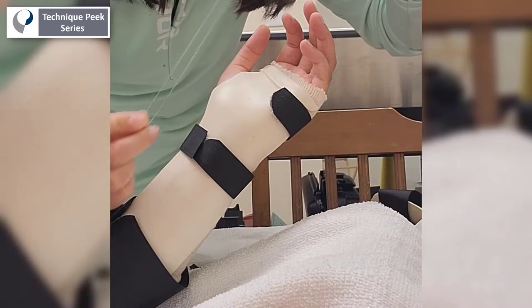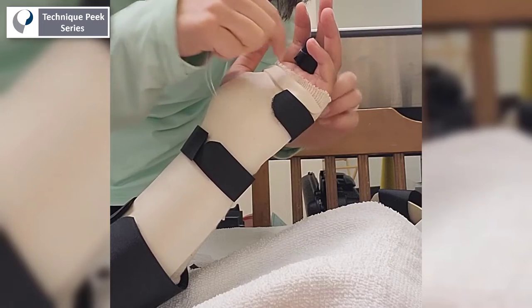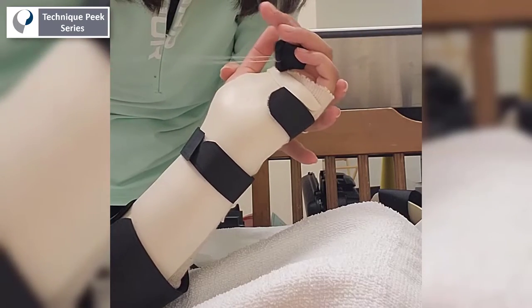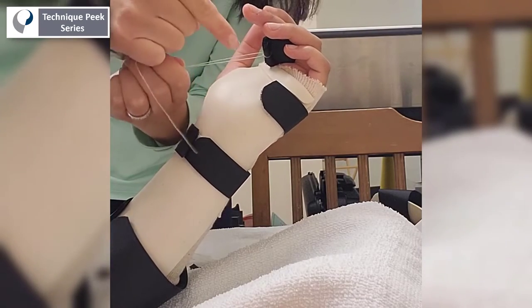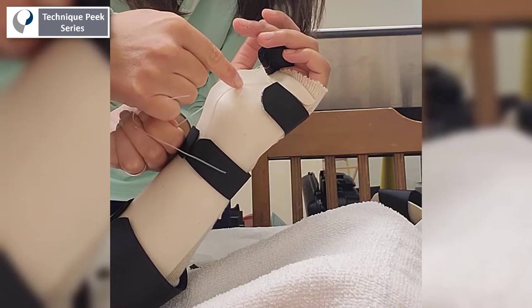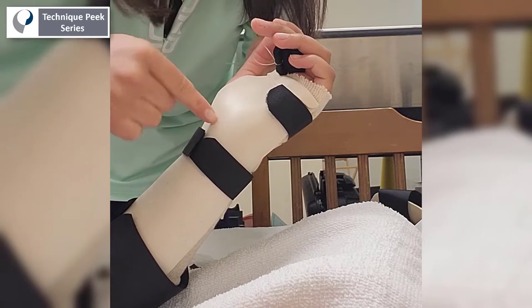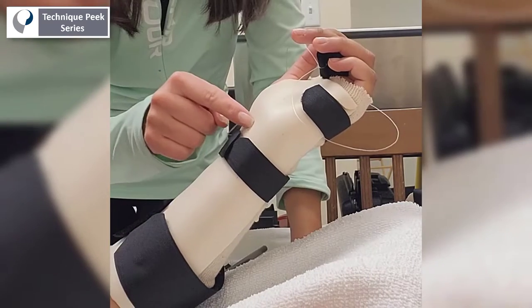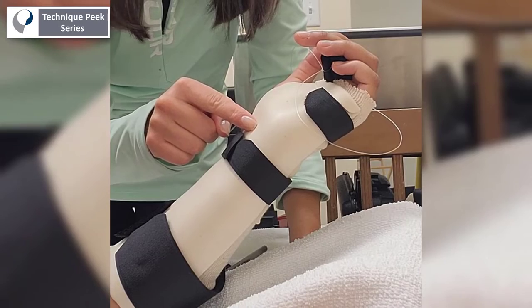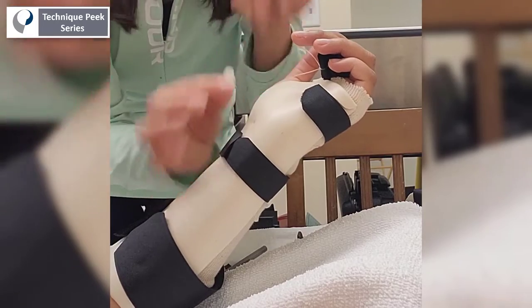Next, we're going to add the dynamic component to the splint. We've made a finger sling using an extra piece of velcro loop and attached some fishing wire to act as the pulley system. Examine the natural cascade of finger active flexion to determine the proper positioning for the line guide. Once the location is identified, mark with your fingernail and punch a hole in the corresponding location to apply the line guide.